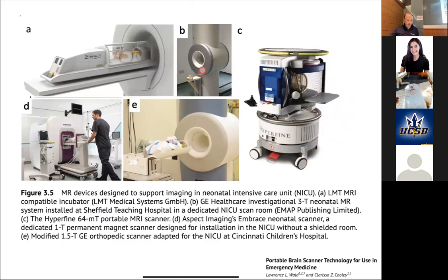But you can see here, there's a real push, especially for things where you could use a smaller magnet. So these are both in ICUs, neonatal ICUs. So really small magnets that you could site in the ICU for neonates, okay? Here's one where they're creating something where you could bring the infant into a regular magnet, but it'd be much easier if you could just scan them right in the ICU, okay? So there's a lot of interest in that.